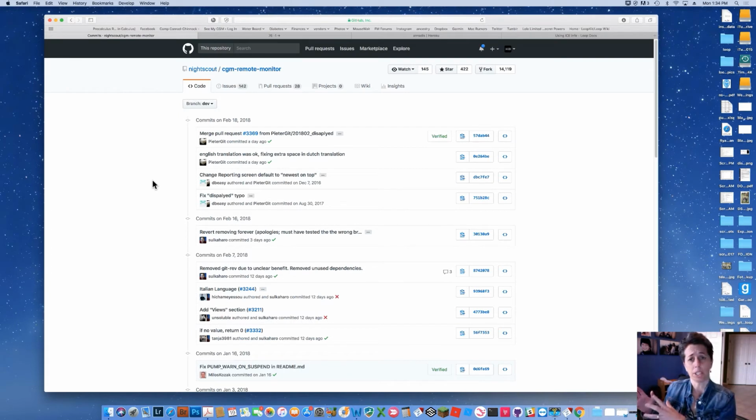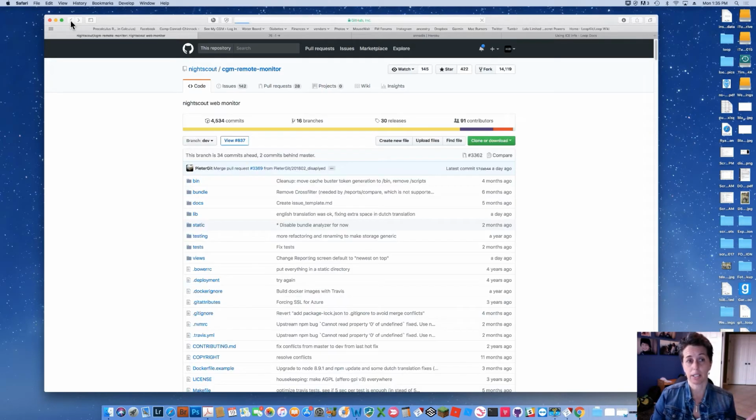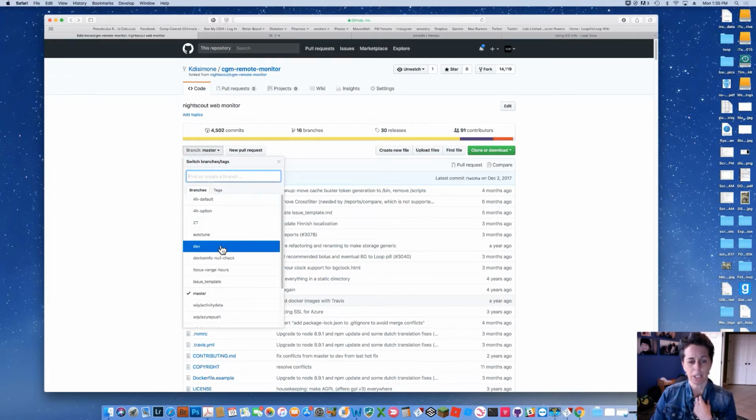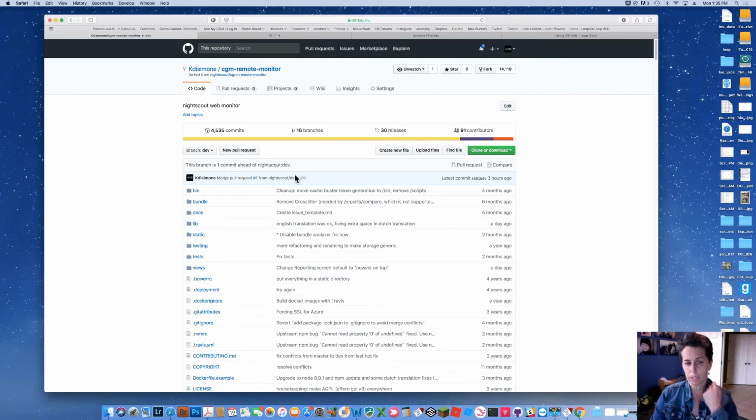And your home version in your account isn't going to be updated automatically unless you go through that compare and update with the pull request, the PR. So in the last video, we covered how to do those pull requests. And so our nightscout site is actually up to date in my repository. My home library is up to date. My master is even. My dev branch is even. We updated those. In fact, it's ahead because of that update. So I'm good. I'm up to date.